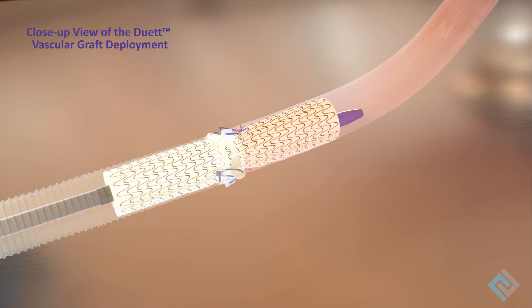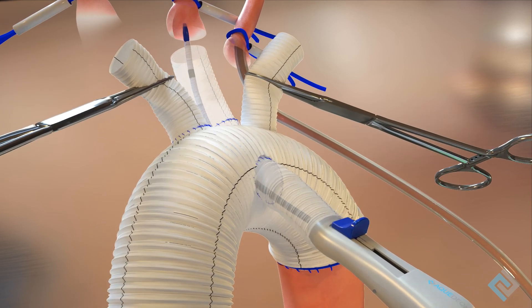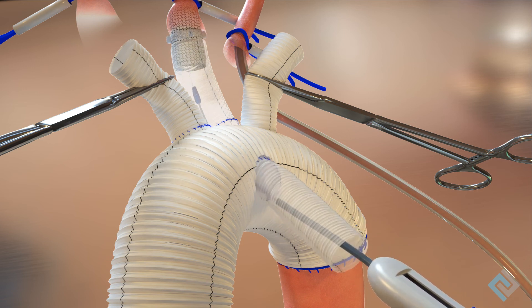Sutures are placed through the suture cuff to secondarily anchor the Duet Vascular Graft to the patient's vessel and the synthetic graft. For arch replacement, insert the delivery system through a working port or an opening in the aortic graft. Retract the slider twice to deploy the self-expanding Duet Vascular Graft within the arch vessel and the aortic branch graft.